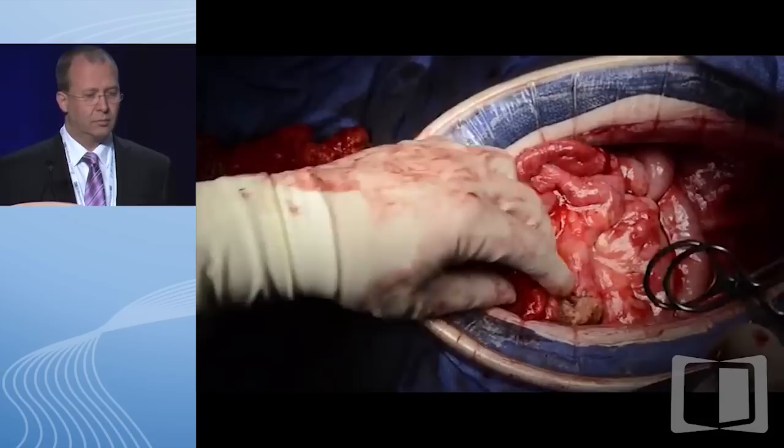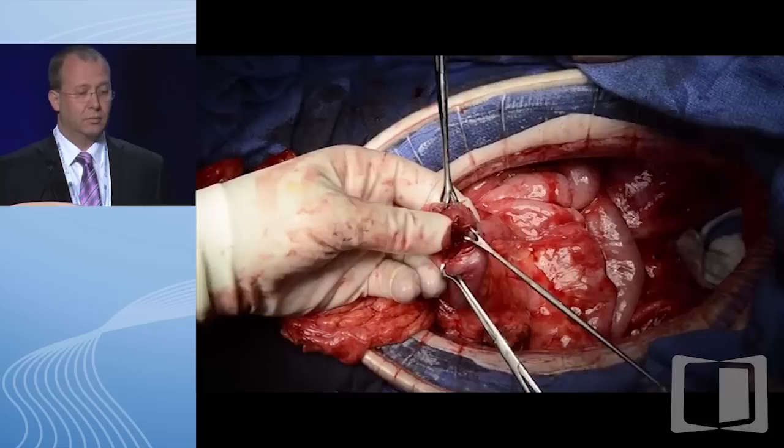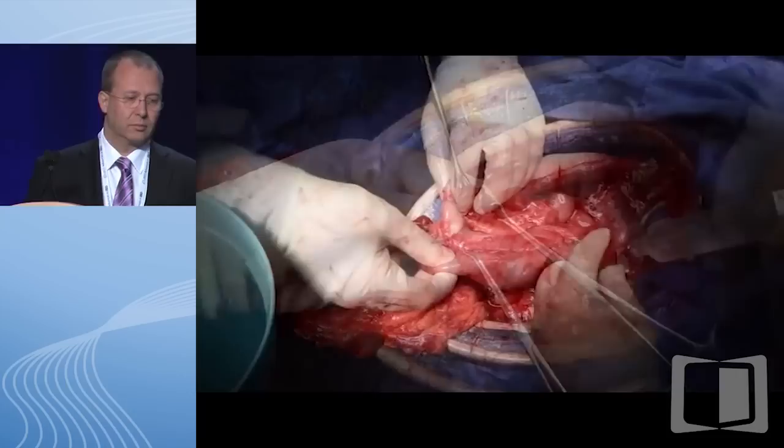In addition, using the enterotomy, the interior of the pouch, particularly the staple line, is also examined for hemostasis, as this should be addressed prior to any anastomosis. Finally, the integrity of the newly formed pouch is assessed by repetitive injections with air and normal saline to assess for a leak.